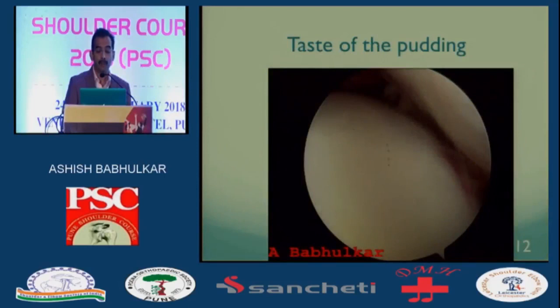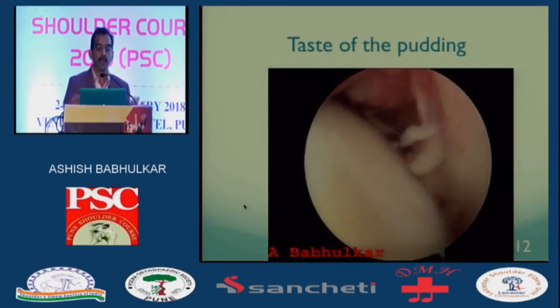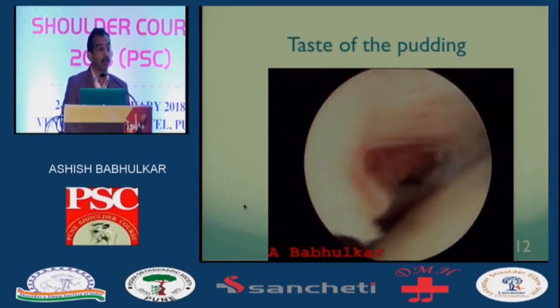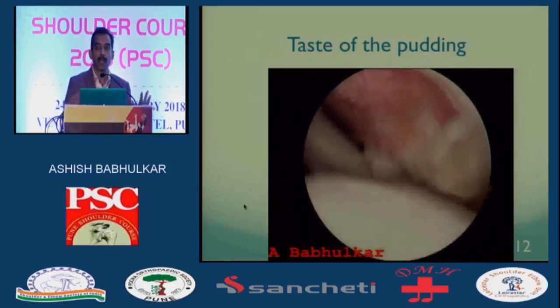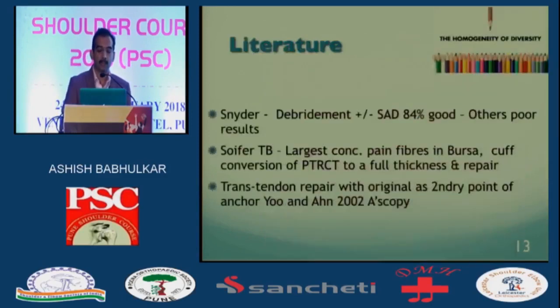At the end, once you've finished, put your scope back in the glenohumeral joint and check that you've done an anatomical repair. You must not have too much tension — it should sit on the footprint, cover the complete footprint, and ensure the cartilage and cuff start off identically. Looking at the literature, there are many ways to do it and there's a lot of heterogeneity, but whatever technique you do, you just must do it right.